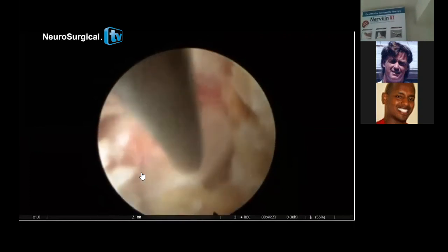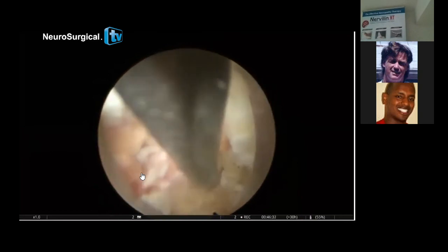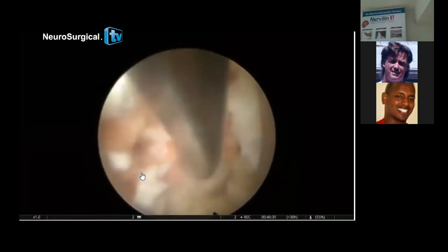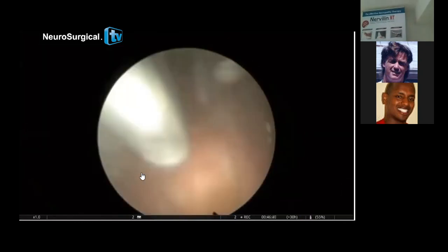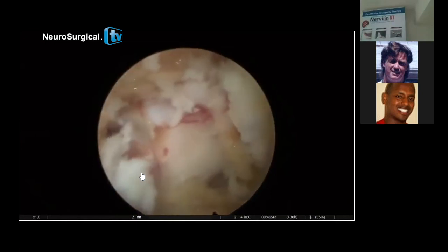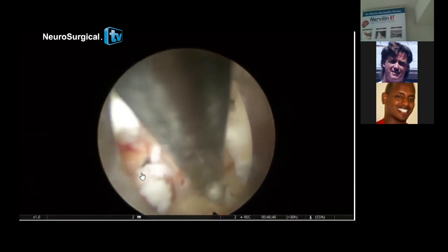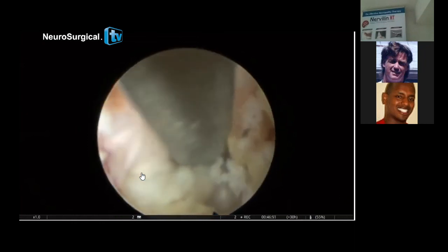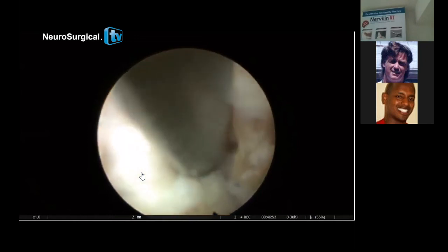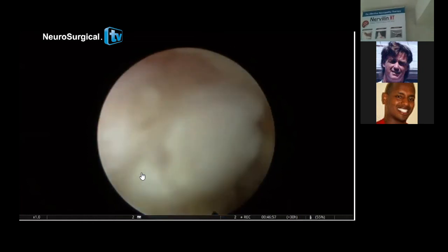You see the root is high, and now please look, this is just under the root, really pressing one, and retracted, but comes again. You see the fragment, small but really displaced. And the operation is done the classical way.